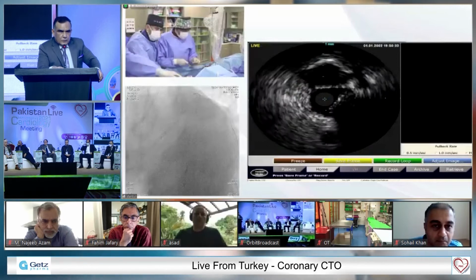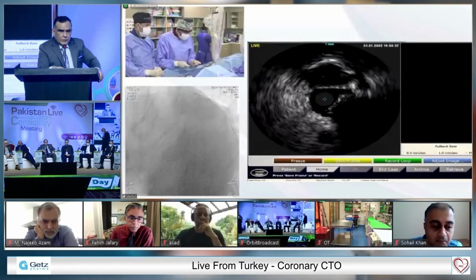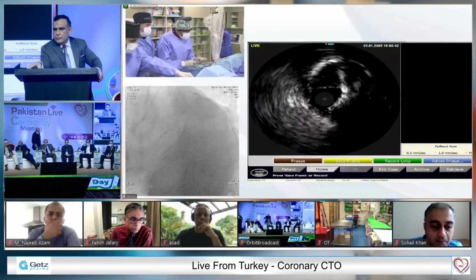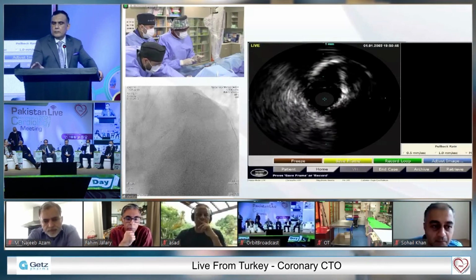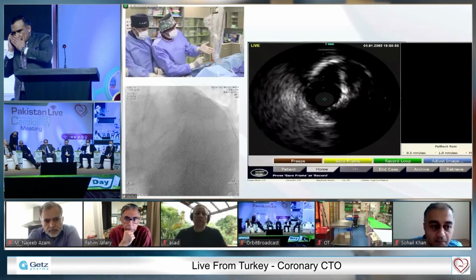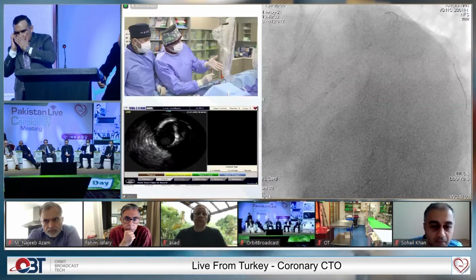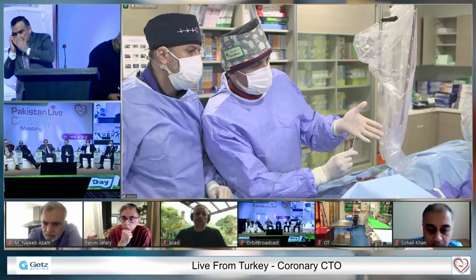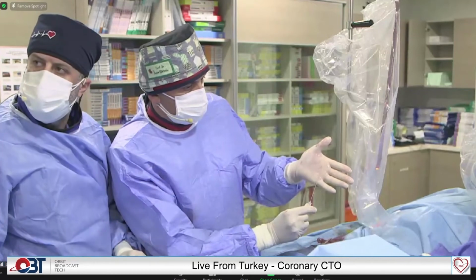And here I give some kind of curve. The tip of the wire, I give one CTO curve, and also now, no, not supporting to go to the LAD. Would you show us, please? Show me. No, bigger, please. More bigger. Bigger, my hand. On the hand. All right, I will do.